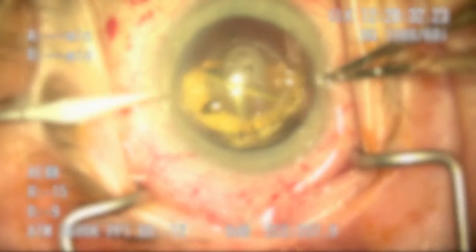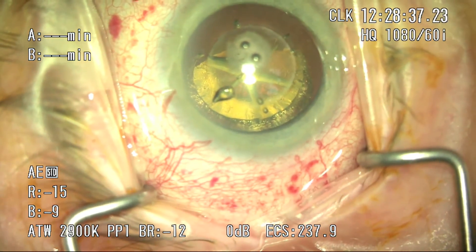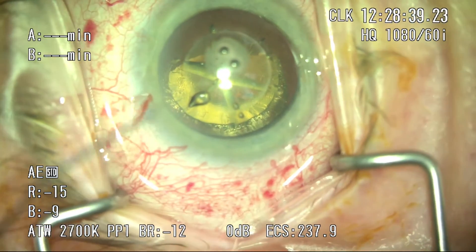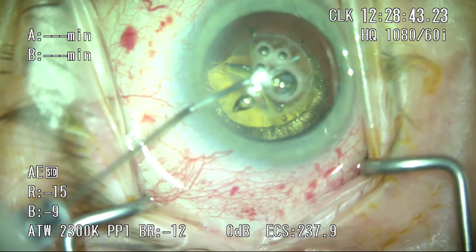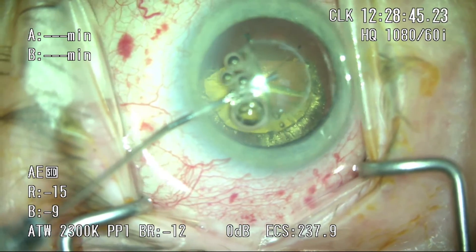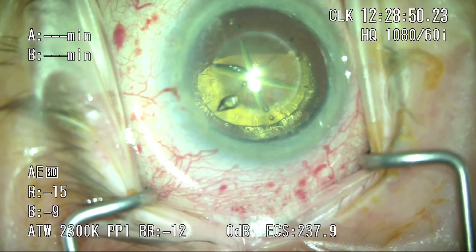The next step is to take the patient to the main OR and complete the rest of the surgery. Here, after making the side port incision, I'm going to inject the viscoelastic. If you're really sure the capsule is free-floating, you can use the viscoelastic to float off the capsule, but certainly in the beginning it's probably wise not to do so. You can see here the injection of viscoelastic pushing the bubbles out and giving a clearer view of the capsule.